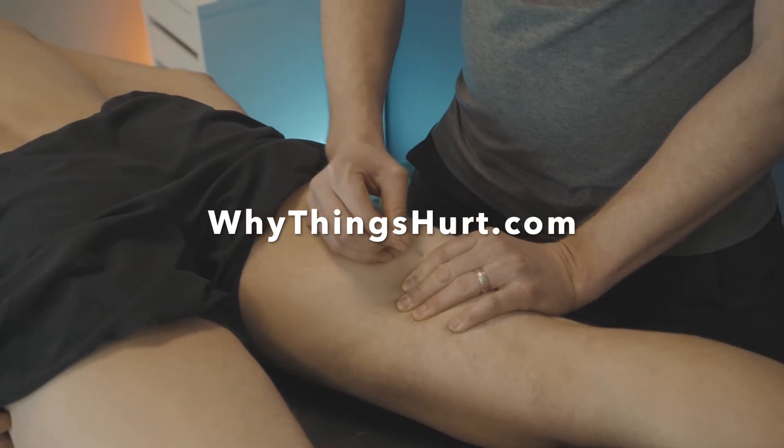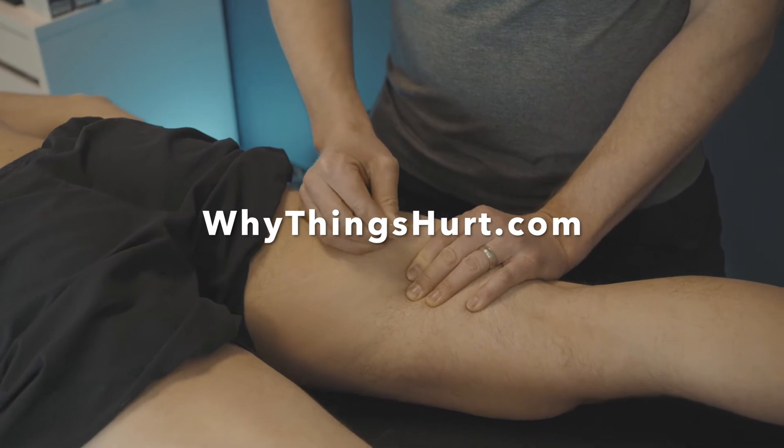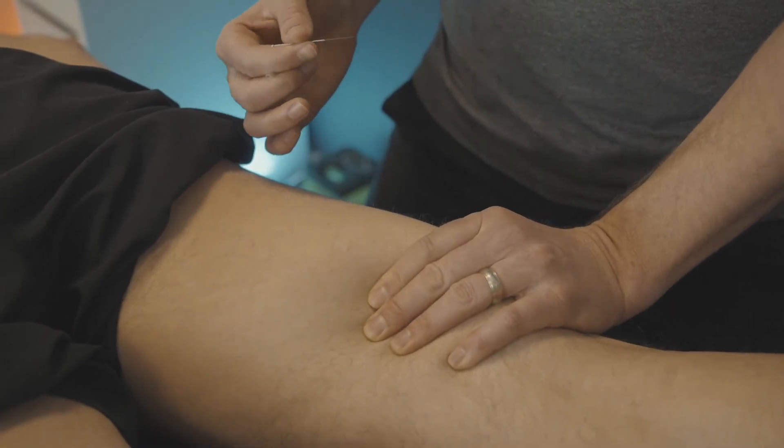As we get in there, you can hunt and peck in a few different directions. And because I am holding onto this, I could feel that whole muscle was kind of contracting in my hand.